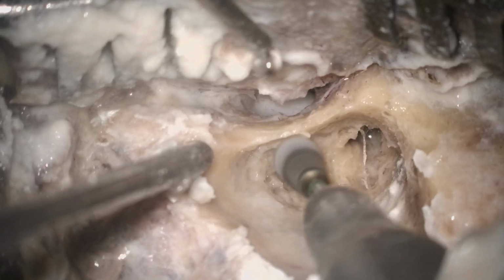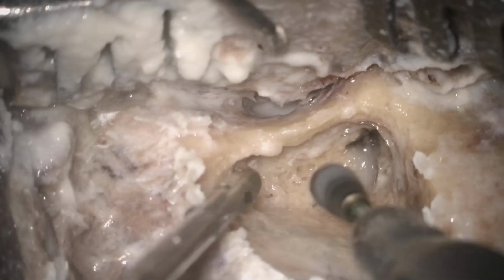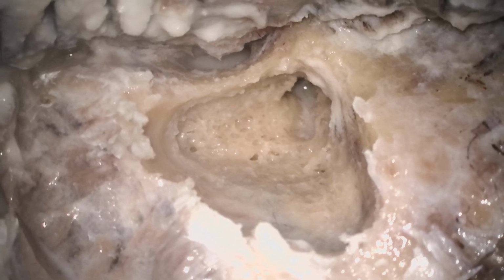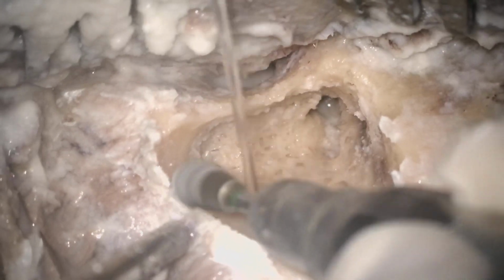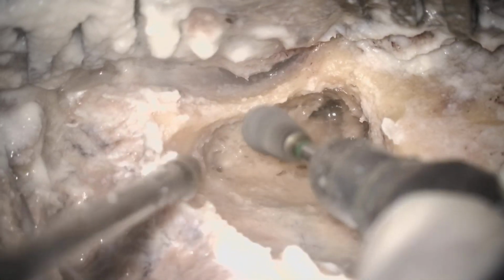So this is the canal wall, and we are removing all the cells from the external canal wall from behind, and we are drilling the tip cell area. Okay, so look, this is the dimension of the cortical mastoidectomy. In day-to-day regular surgery, you should drill like that, removing all the cells, because if there is an infected cell in the tip cell region or there is some accumulation, that should be cleared. This is the idea of cortical mastoidectomy.